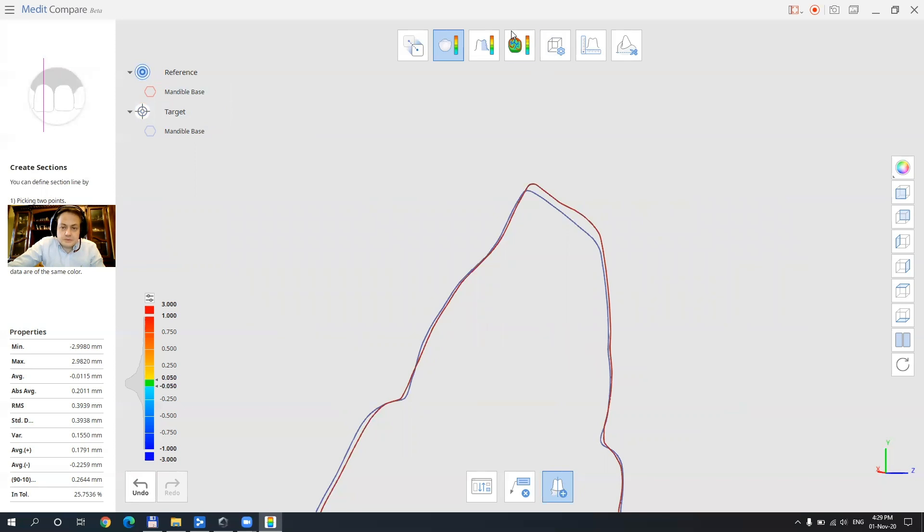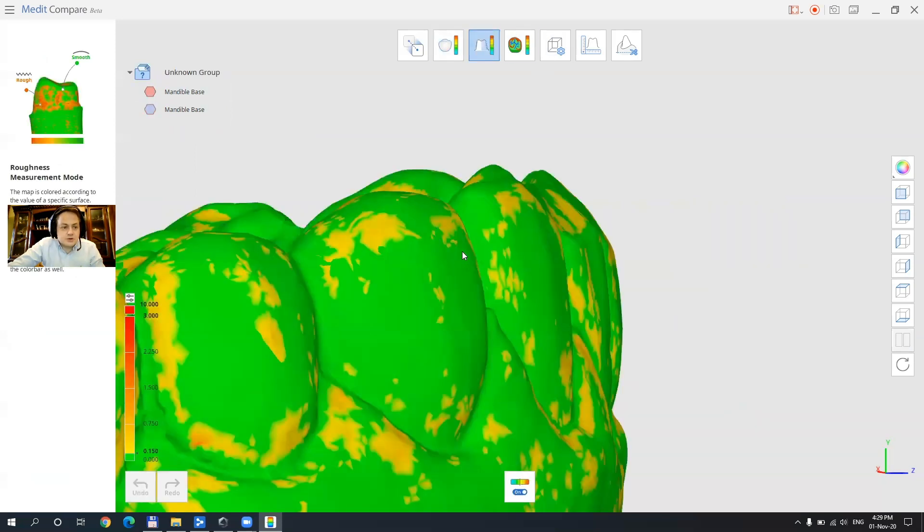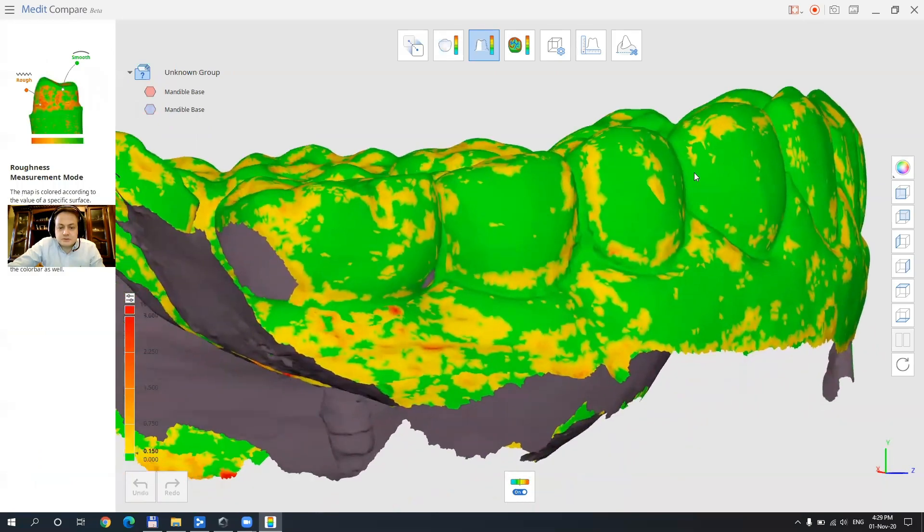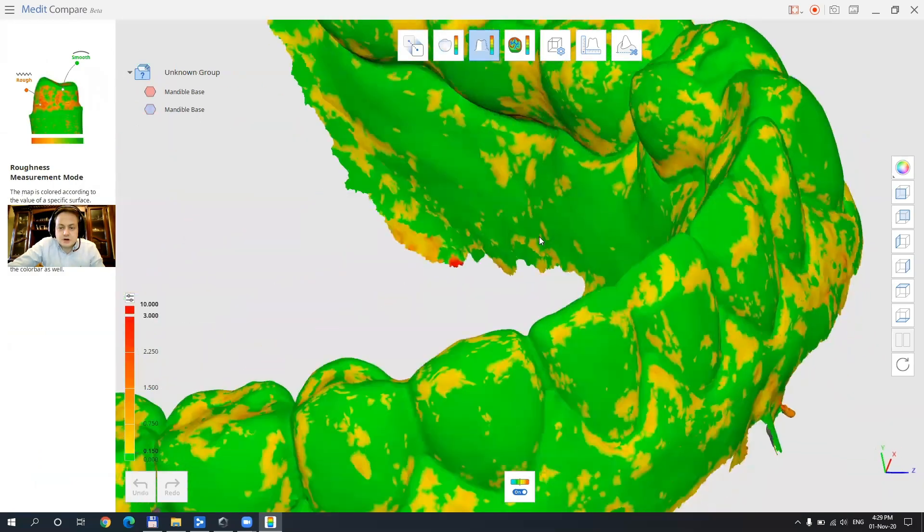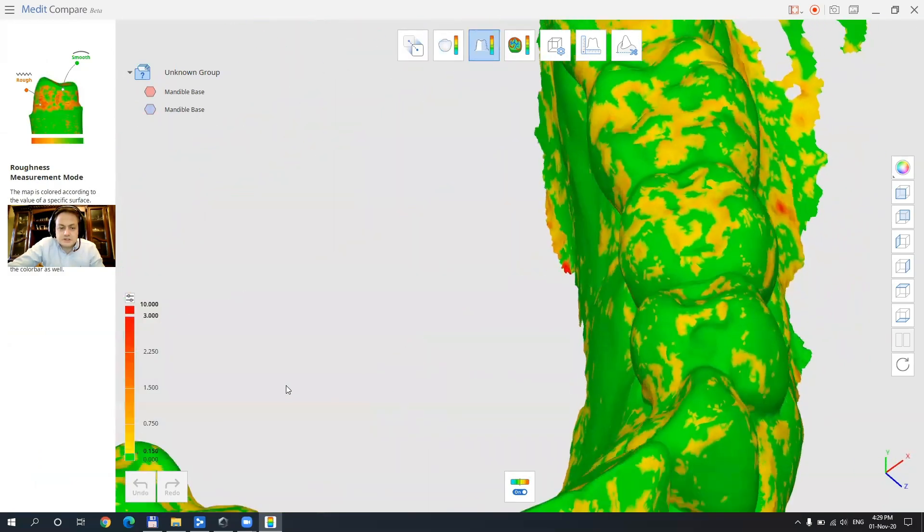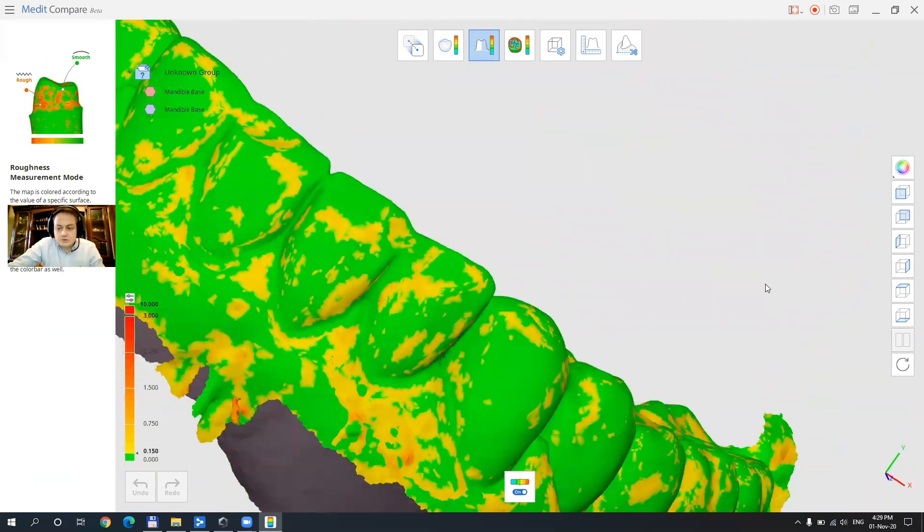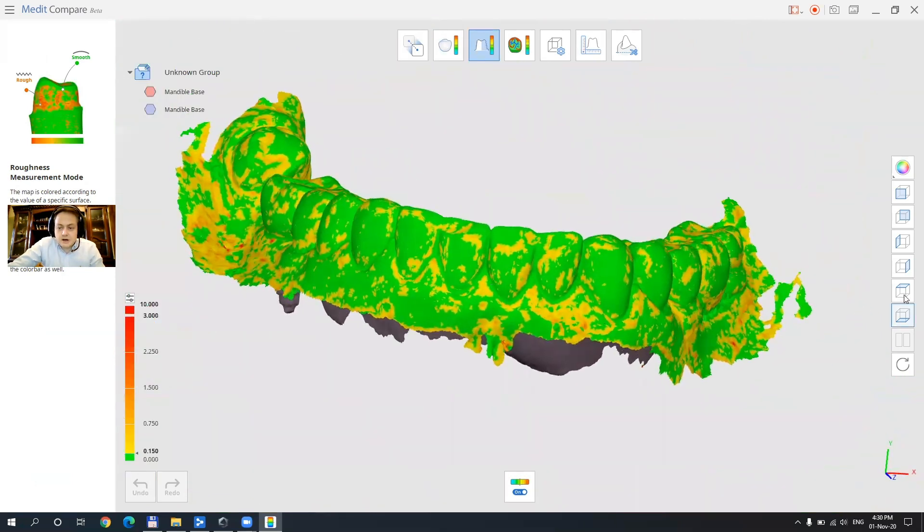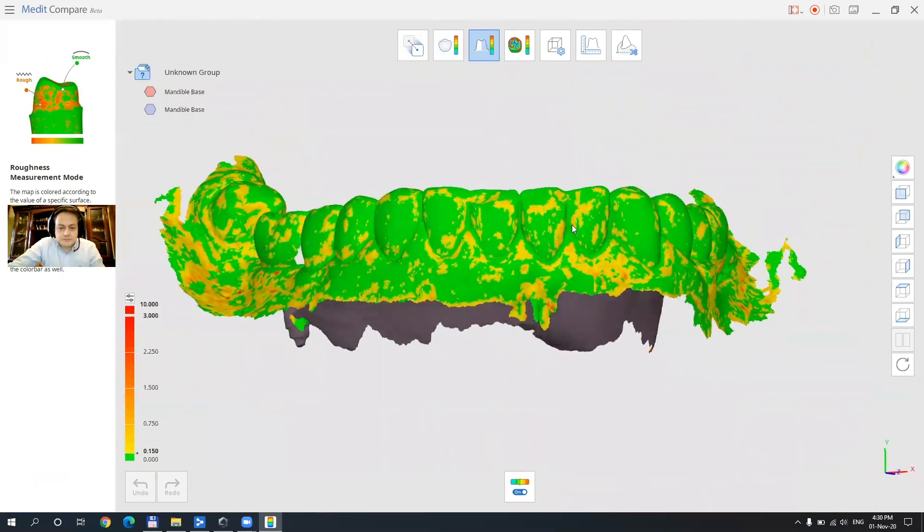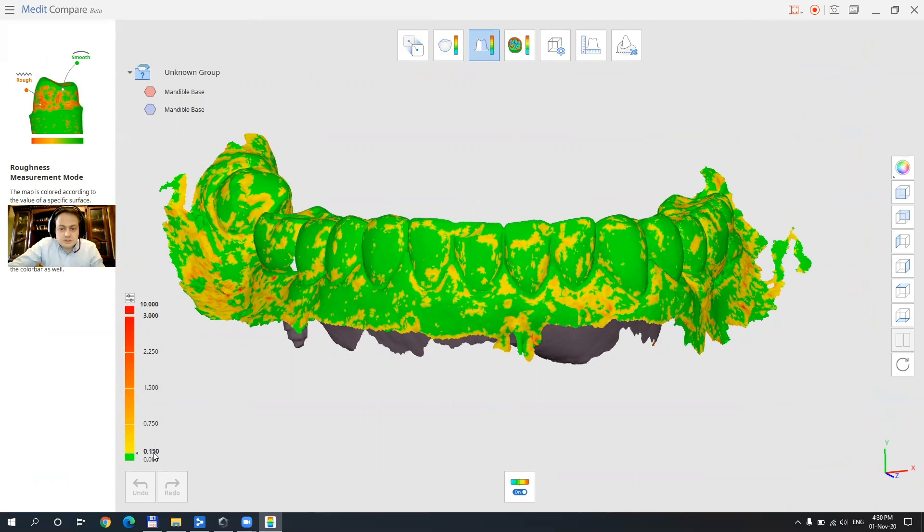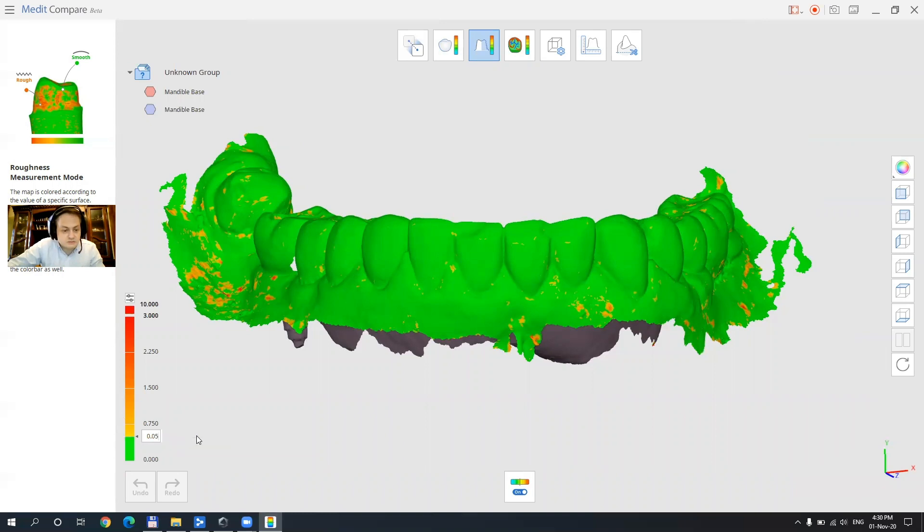Okay next function is going to show us the roughness of the model so how smooth or rough the model is and this is also available by value. So if we want to modify the 150 microns that is considered smooth here we can just enter let's say 50 and always 500 or 50 microns as well.